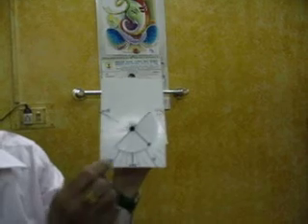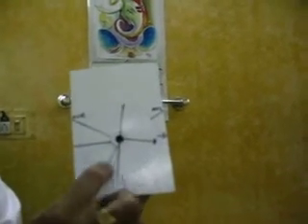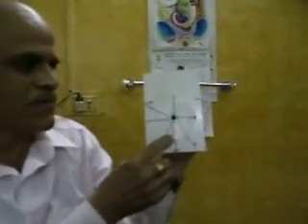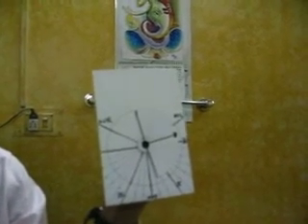For example, if your ECG shows lead 1, 2 and AVF positive, but if lead 3 is negative, you just have to shift this semicircle slightly towards this side so as to expose lead 3, and what you see here is the direction of the axis is about plus 10 degrees. If you have an ECG in which even lead AVF is negative, then you shift it slightly towards the left, and then the axis becomes minus 10 degrees.